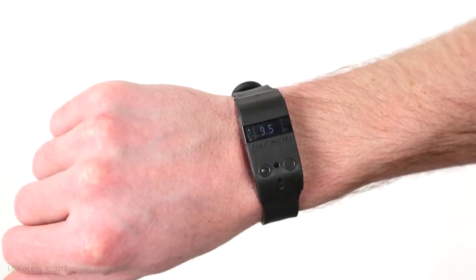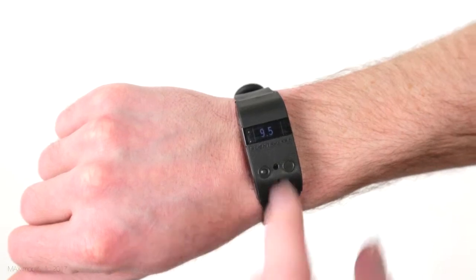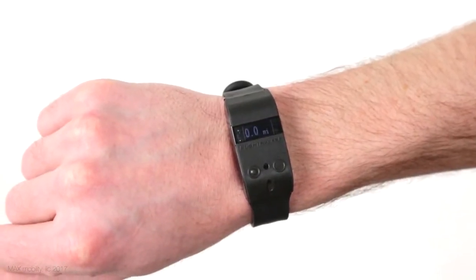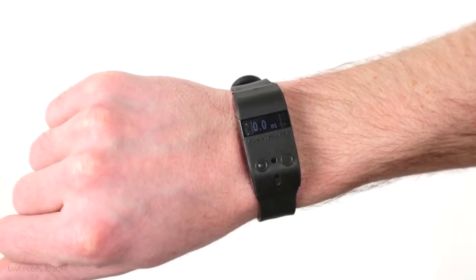Another tap brings up your calculated average coast time for the current day, or the time that passes in between each push that you perform. This is a new propulsion metric that we have created that you want to maximize, or get as high as you can each day. One final tap shows the distance and the chosen units that your smart drive has driven for that current day. This and all the other propulsion metrics reset to 0 each day at midnight, but it is capable of storing up to 100 days of data to be viewed on the app, which we will talk about in a bit.